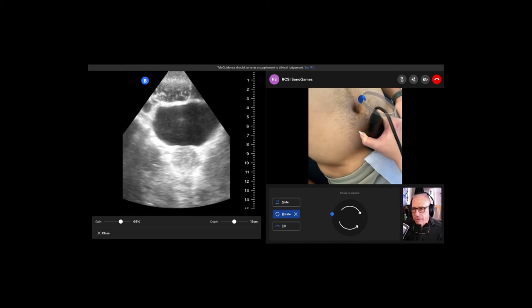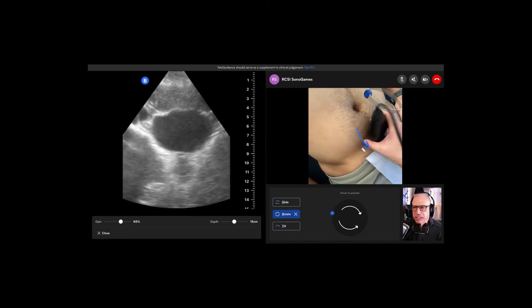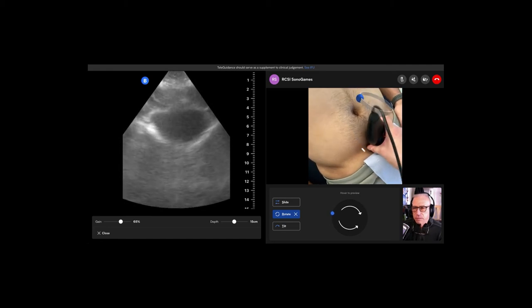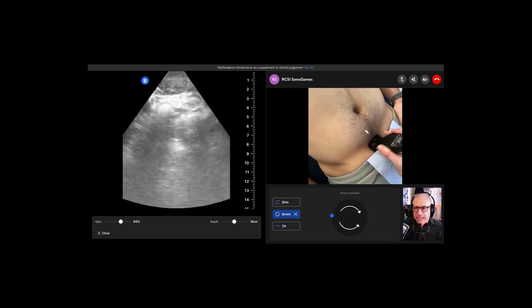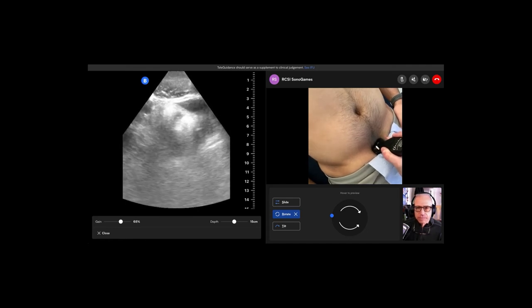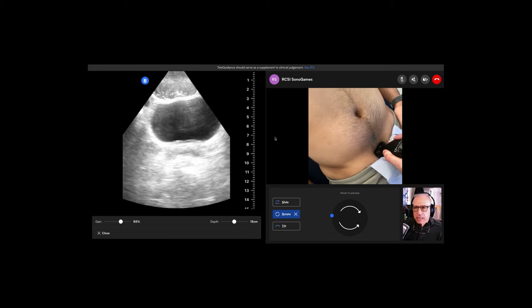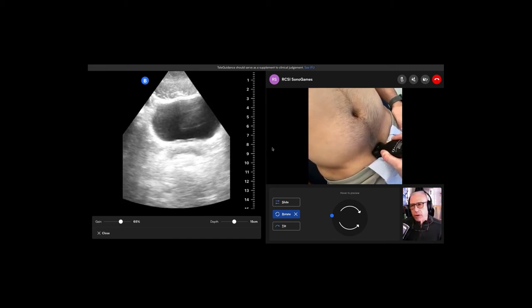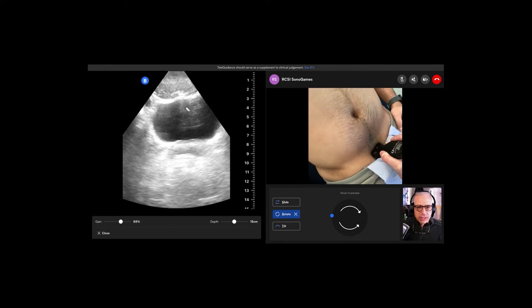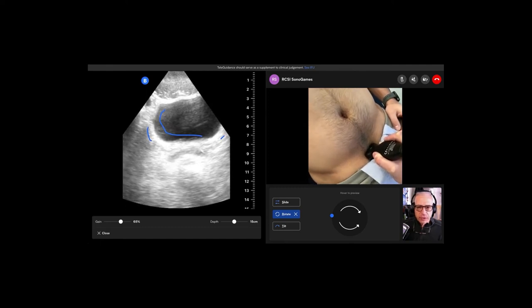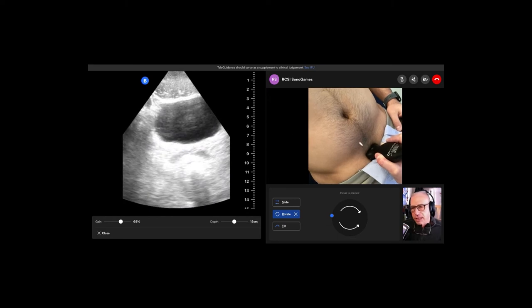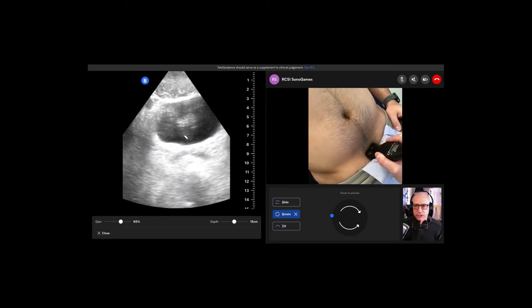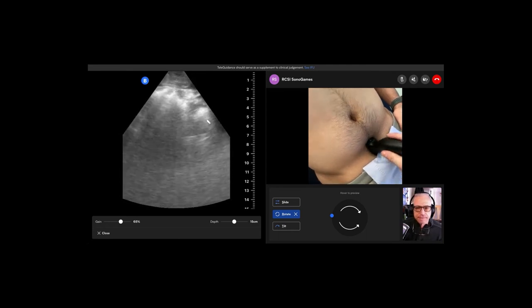Slide down. Take your hand and slide this way until you're bumping into symphysis pubis. Vertical. Okay. Like that. And slide down low. Just keep on sliding down until it stops on bone. And then, see the difference? Oh, okay. So one thing that's really important now, what I'd like you to... So that's cool. That's a beautiful view. There's bladder. There's no fluid here. No fluid here. There's seminal vesicles, but nothing else. I want you to rotate so your dots towards the head. Let's do a sagittal. I think it's really important for trauma to do sagittal views, and I'll tell you why in a second.